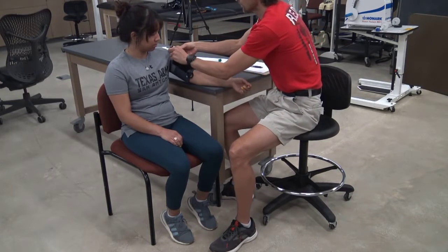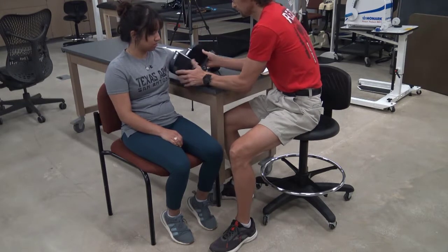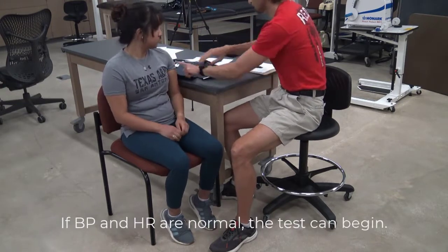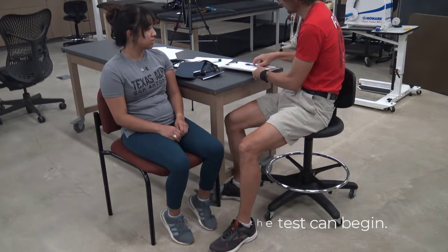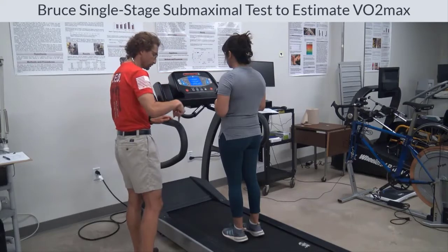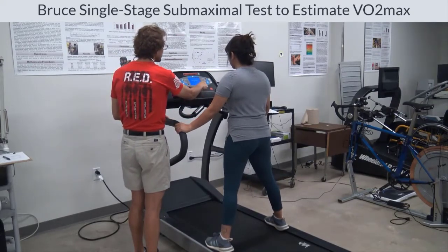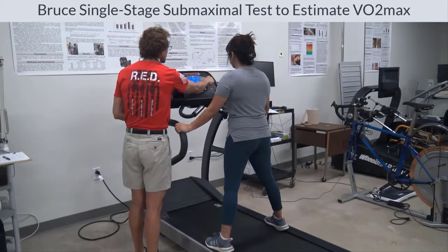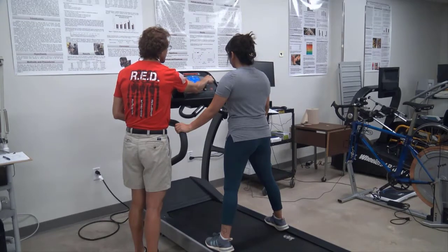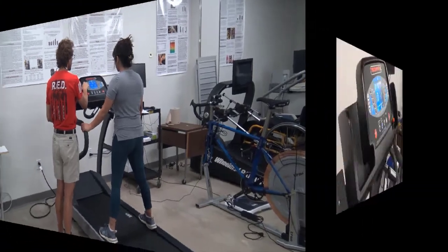For this demonstration, we'll be using the standard Bruce protocol. Once blood pressure and heart rate have been measured and are within normal ranges, your client is ready to begin the test. Have your client straddle the treadmill before you bring up the speed and grade. If the treadmill starts very slowly, it is acceptable to allow the client to remain on the treadmill as the speed and grade are brought up. Just be sure they are holding onto the rails to prevent them from tripping.